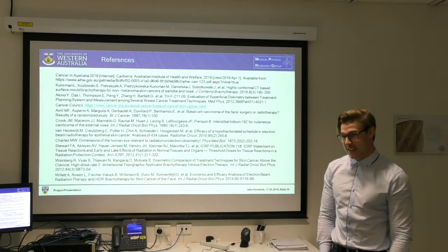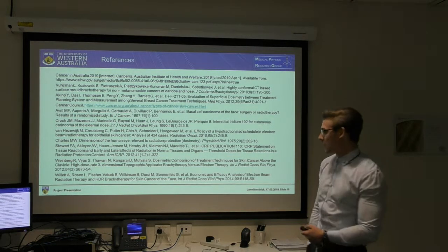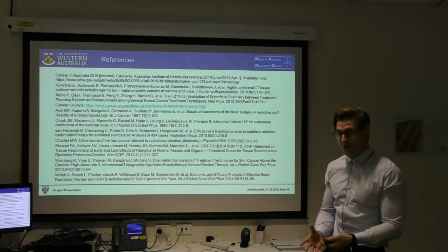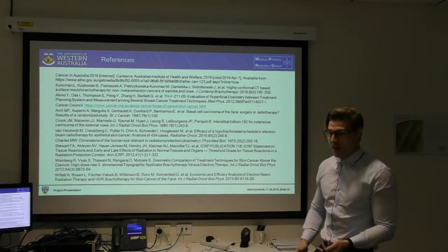If you had to prioritise it, what would be a reasonable outcome? I think probably the main thing is to create those 3D dose reconstructions. If we can do that, we can compare those to the treatment planning system calculations and see if they match up.